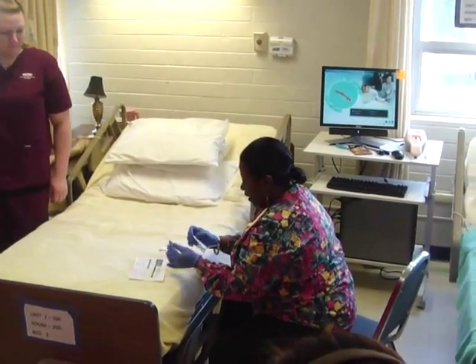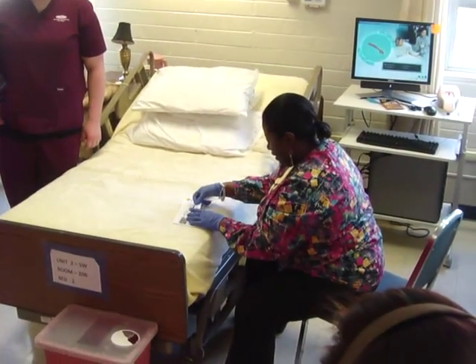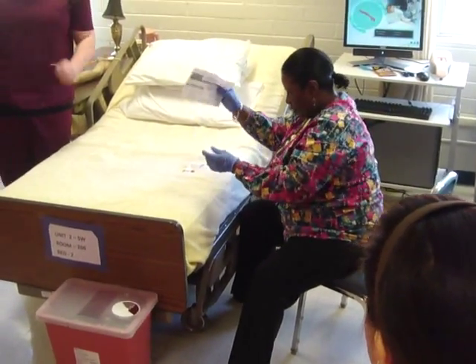The baby's label goes on just like that. I have to still sign off on my sheet — time, date, sign off on my requisition.